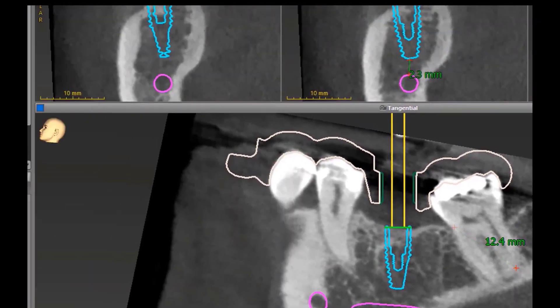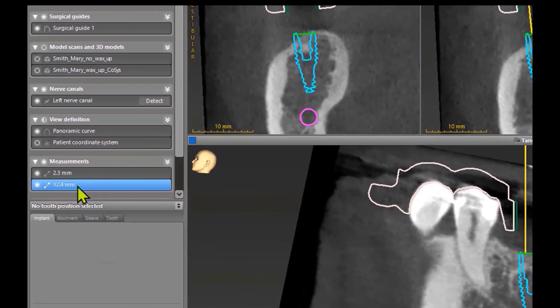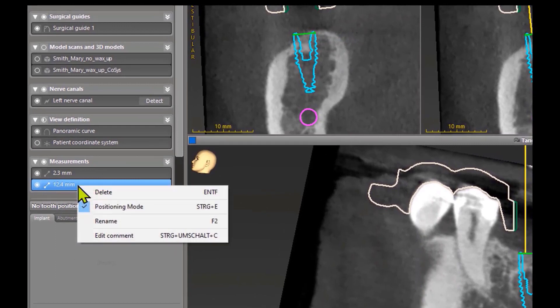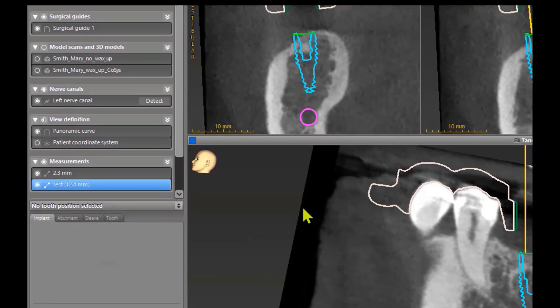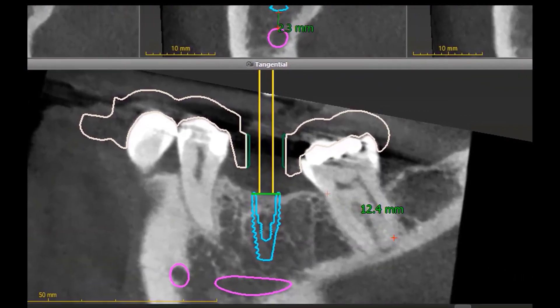You see them on the left side. Right click on a measurement, rename, then you can give it a specific name, and if you click OK you have your name and the number of the measurement — the figures in brackets.